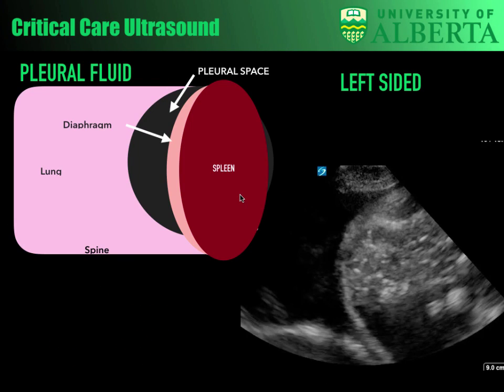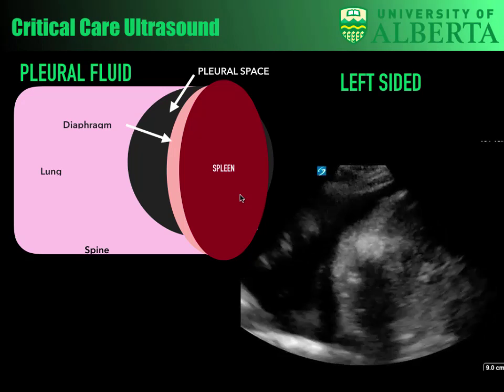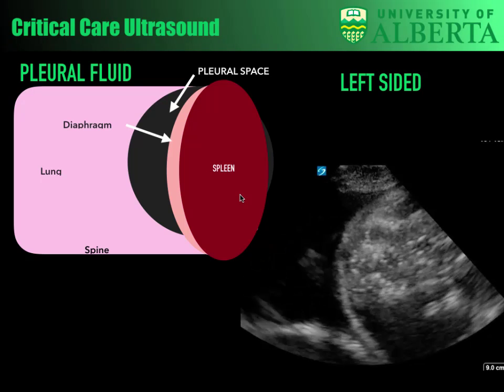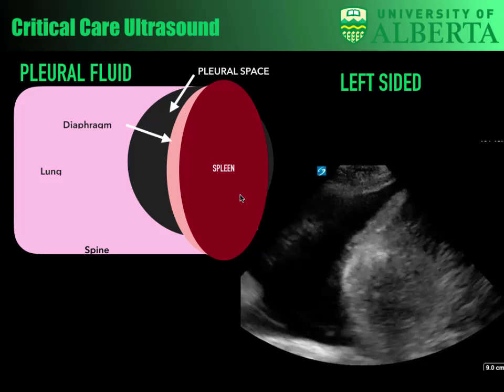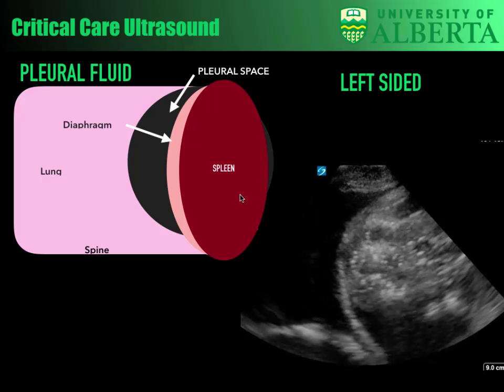Now you can look for a pleural effusion too. I know this is jumping the gun. We will have sessions in the future looking at assessment of the parenchyma and pleural space. But this is the left side.